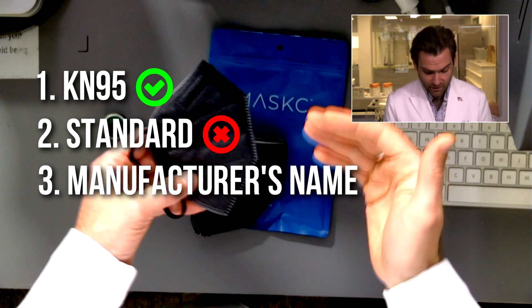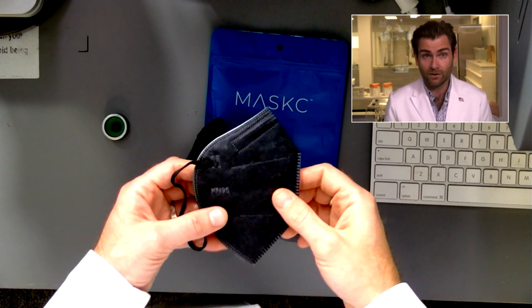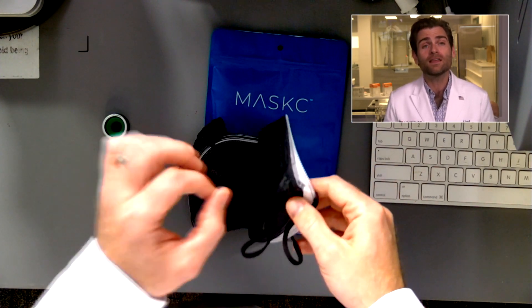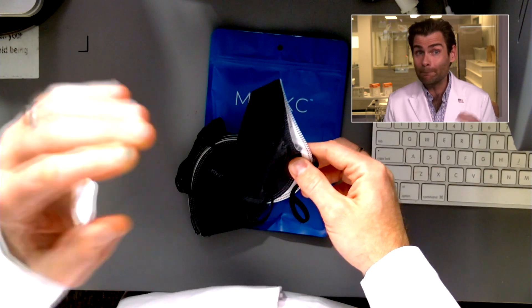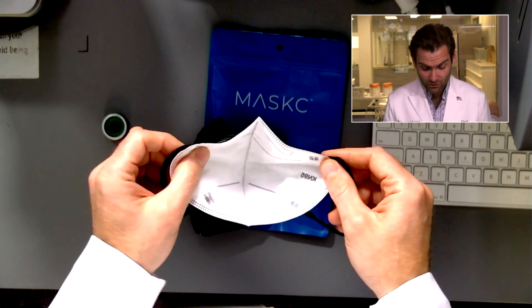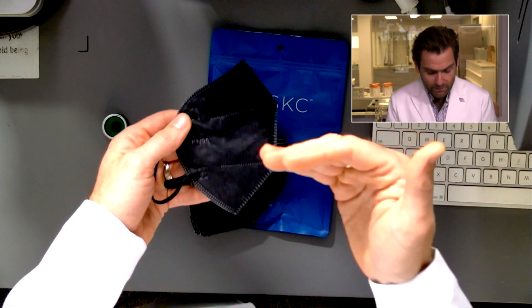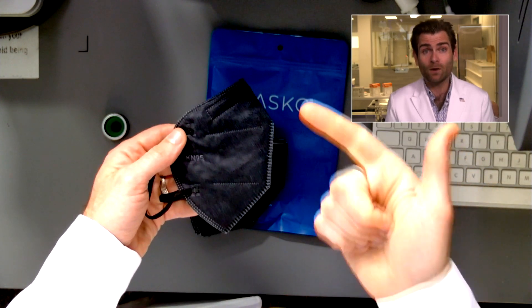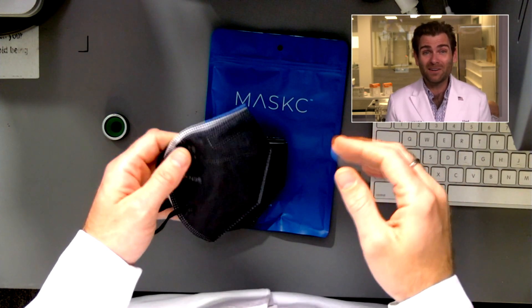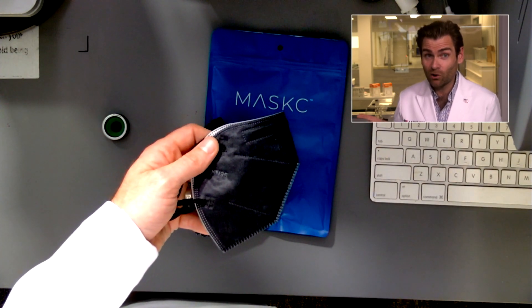You also need to have the manufacturer's name. You could put Mask C, but we know they're not the manufacturer — technically you have to have the actual manufacturer's name. Why does all this matter? This is a medical product made to basically save your life. The Chinese standard requires you to be able to see who's making it so you know if you can trust them, and which standard they're being held to. They don't have any of that — they're robbing you of that. And I've found that when a brand doesn't do these simple things, the machine calls them out on it.